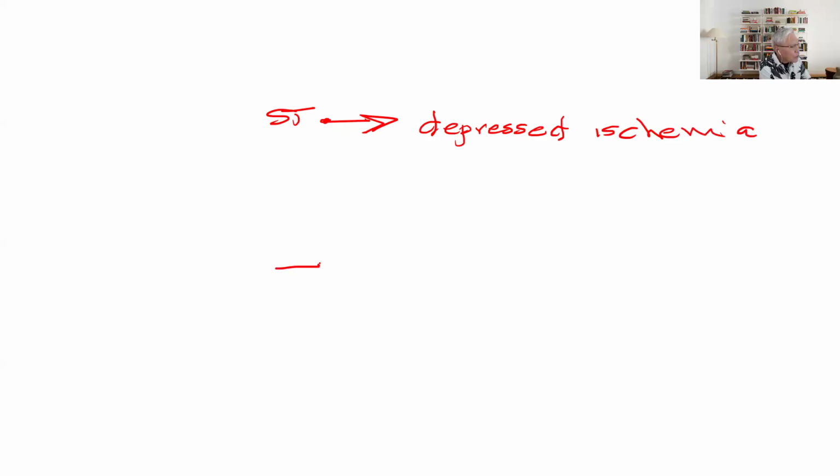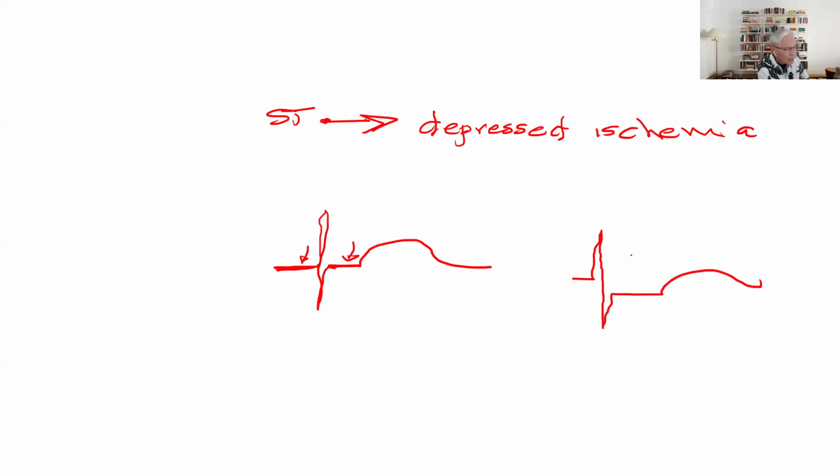So usually when you have a QRS complex like this and the T wave like this, the ST segment is the same as the baseline right here, okay? That straight line. This is what's called an ST segment at the baseline. However, in some instances, what happens is if this is the QRS complex, the ST segment might be here, okay?